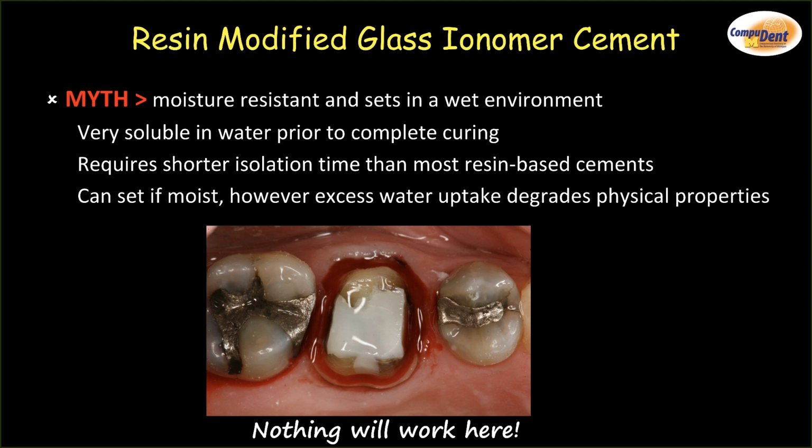Now, the reason a lot of people like to cement it, I can do it quicker. I don't have to control the environment as long. Now, keeping things simple and doing them efficiently is an advantage. That's not a disadvantage. Okay, I know a lot of people think, well, if it's simple, it's probably not as good. No, no, no. The advantage of doing things simply is that you can predictably repeat them. Predictably repeating your process builds accuracy over time.